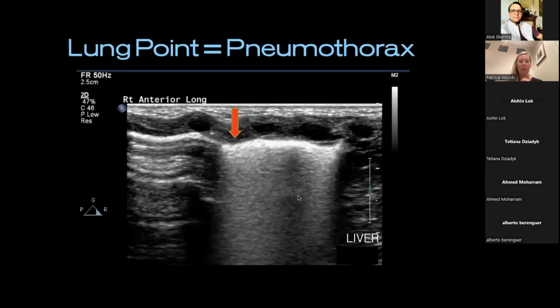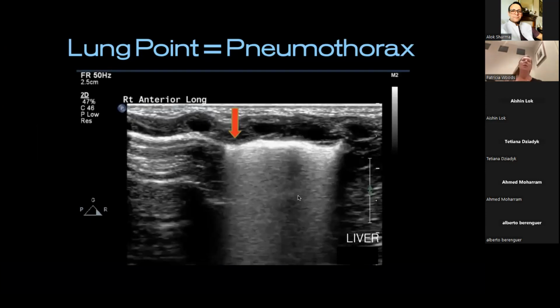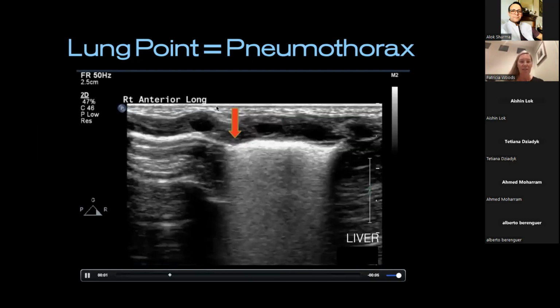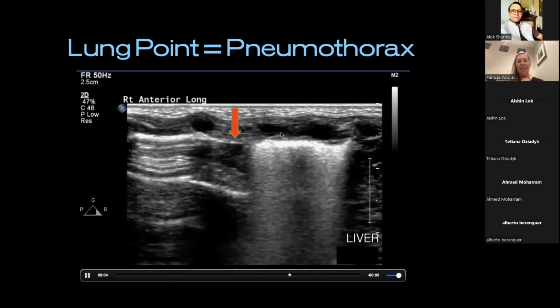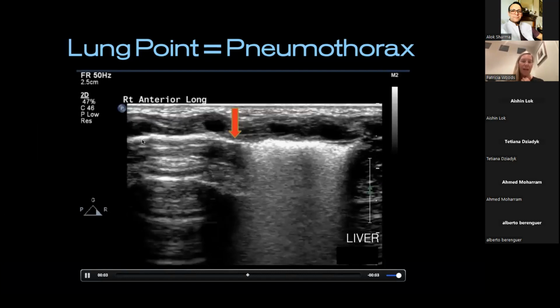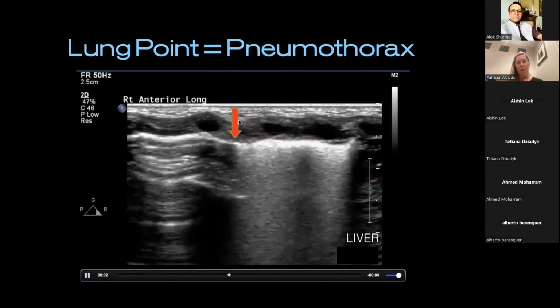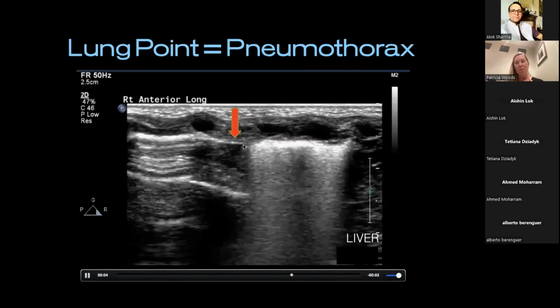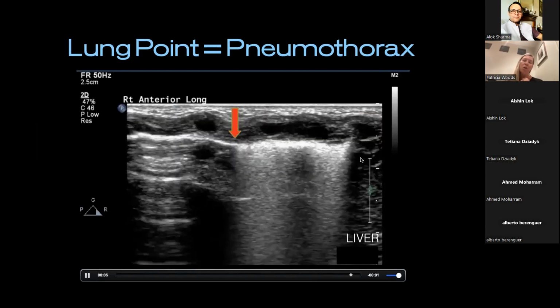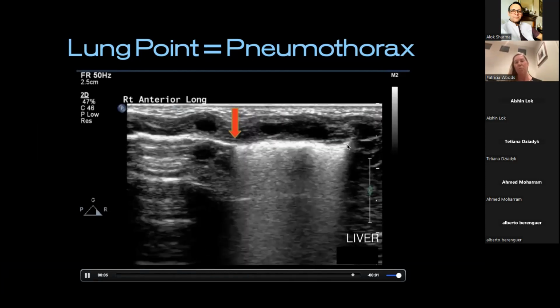So another example here. This is a standard right anterior longitudinal plane that you would have in the midclavicular line. So the probe notches up towards the baby's head. You see here lovely chest wall tissues, ideally a symmetrical appearance of each little rib shadow. And then again, think about the pleural line definition, even changing within one rib space. There's no real other explanation for that in that area. You can see inferiorly, perhaps you've got solid organ coming in here for sure, and then this artifact dominating and wiping out normal structures.